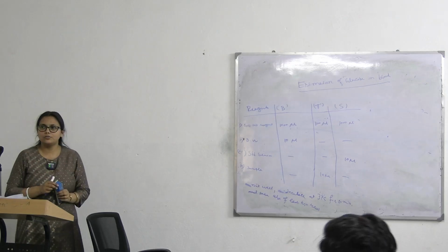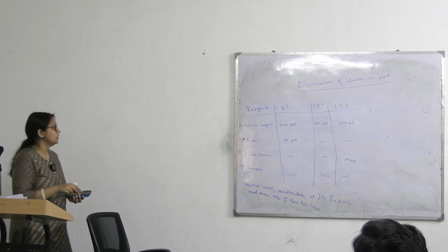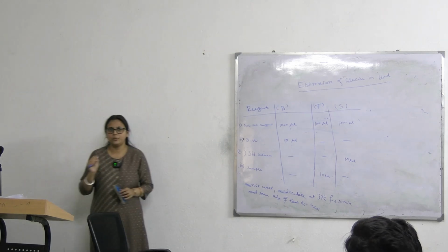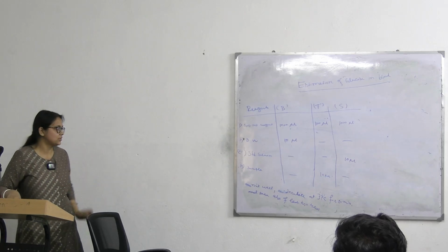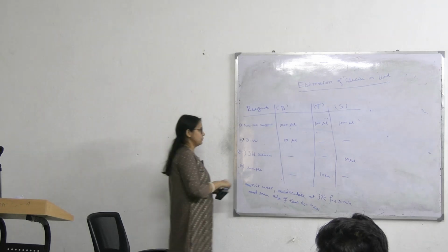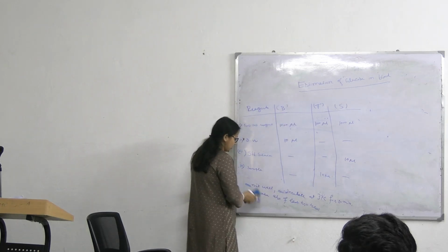And standard solution in the S test tube, and blood sample in the test tube. Okay, and you have to mix well. Don't make a mistake, you have to mix well and wait for 10 minutes at 37 degrees Celsius, that is in summer season.